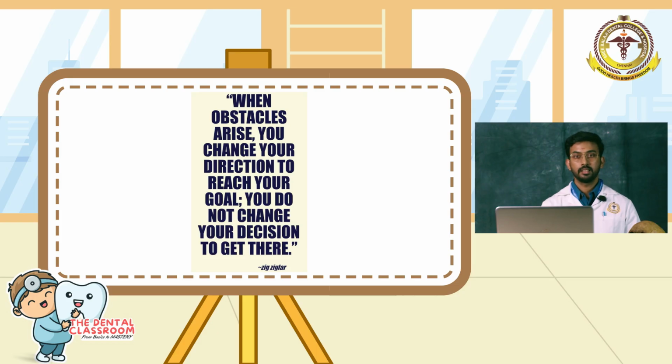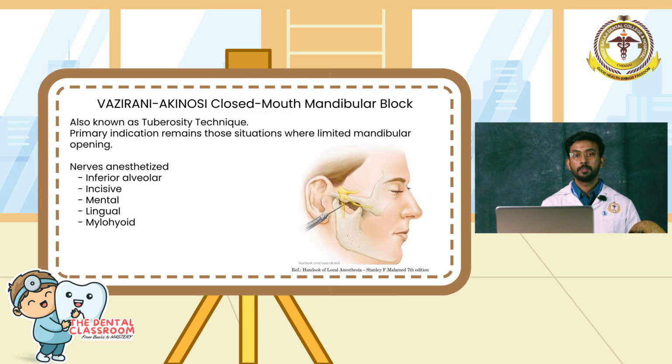When obstacles arise, you change your direction to reach the goal, but you do not change your decision to get there. All those patients who present to you might not present with an ideal situation with complete or adequate mouth opening. Some might present with reduced or inadequate mouth opening. In such situations, even if we have to proceed with the treatment, we might need an alternate to our classical nerve block technique.